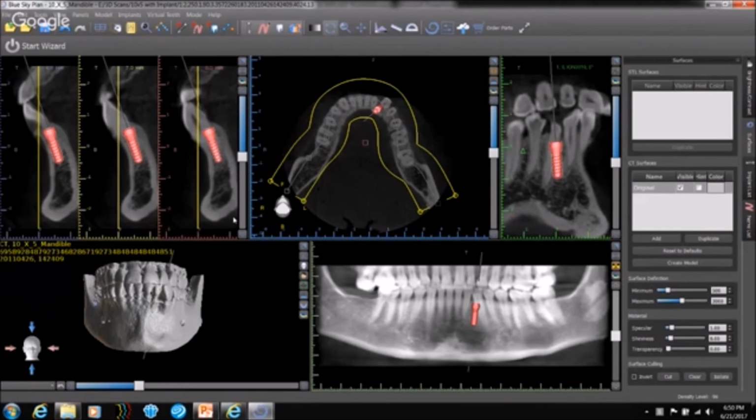The most common thing that I see, and we haven't touched on this, is that the density of the bone has become slightly confusing, because the traditional density measures such as D1, D2, D3, D4 did not apply over here. There is this misconception that maybe this type of imaging is not the right way to go. That's not true.